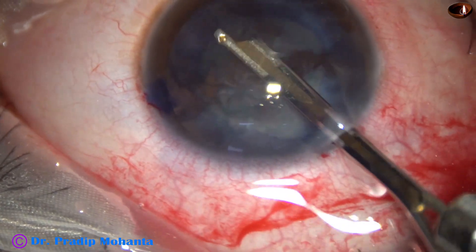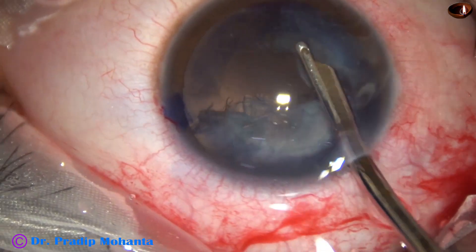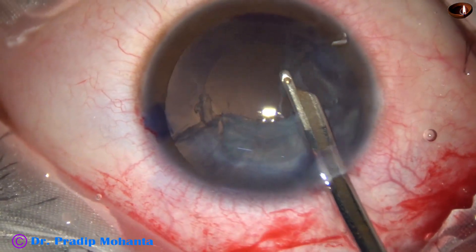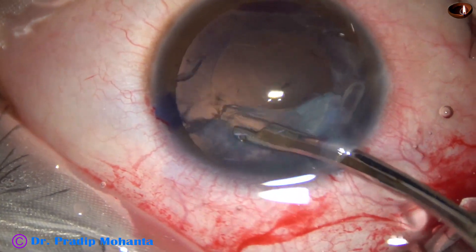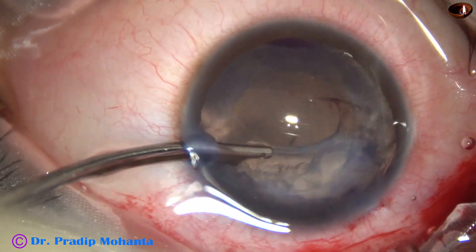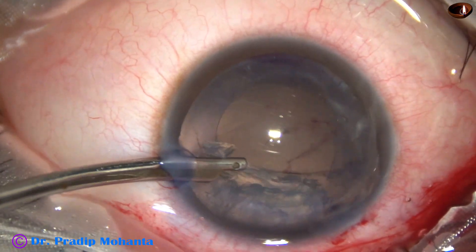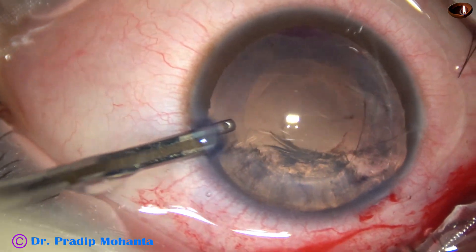Most of the cortical matter can be aspirated before vitreous prolapse. Still now, vitreous prolapse is not there. Now the vitreous is tending to prolapse. I see a huge rent extending from 4 o'clock to 10 o'clock. I go through the side port and I am able to aspirate some more cortex from 10 o'clock. At this time, I find there is some vitreous prolapse.